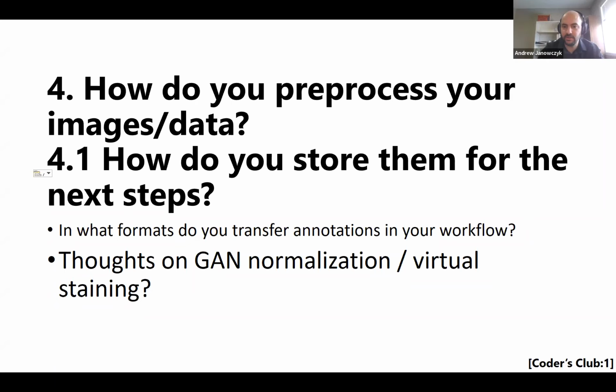It's a boring issue that literally every one of these discussions ends up at, which is that formats are annoying to deal with. So let's all just pick a format. And I agree with the comment that someone made earlier that it seems to be coalescing in the DICOM direction, but that's kind of a conceptual coalescence. It doesn't seem to be translating to the actual data sets themselves.